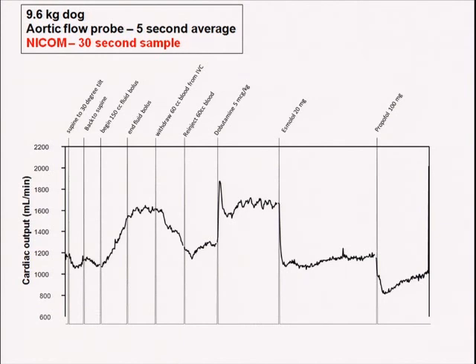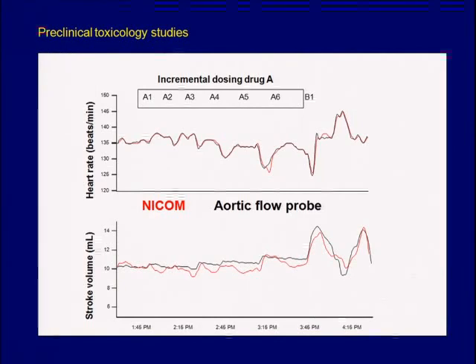The NICOM comes out at a 30-second sample. It looked like this. And I kind of went, this is a little interesting. There may be something here. Eventually, we went on and we looked at a variety of these where we were giving incremental dosing of these drugs and looking at side effects.